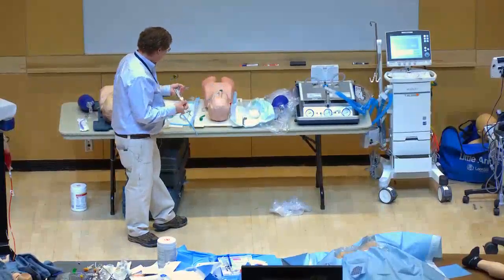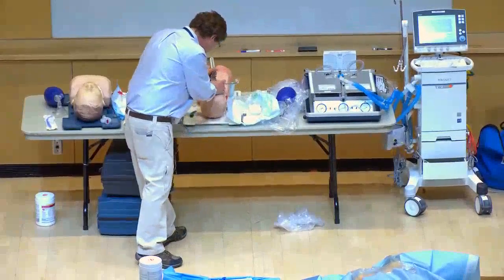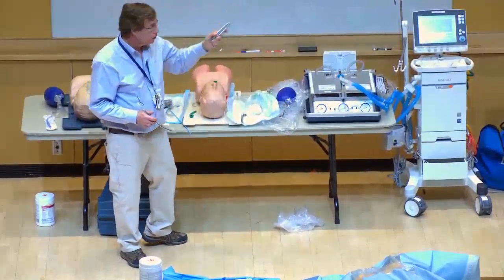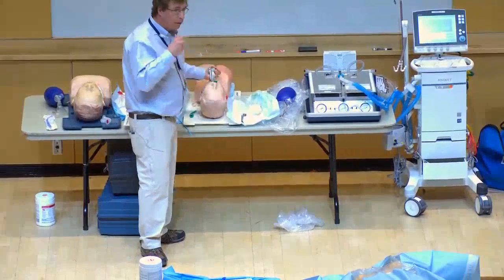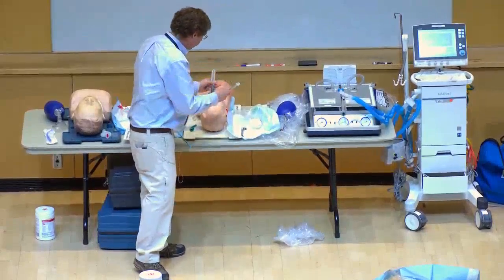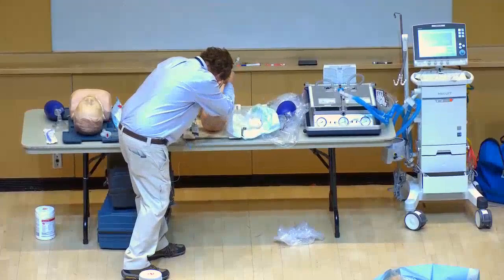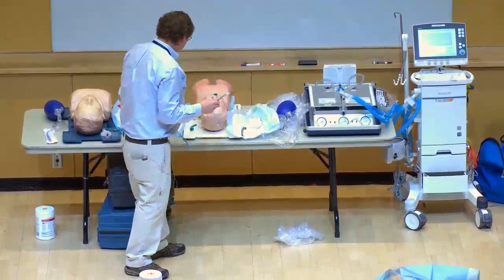For video laryngoscopy with the GlideScope, you insert it similarly to a regular laryngoscope and view on the monitor. The reason we use a GlideScope for COVID is you don't have to get as close to the patient — you can stand further away and pass the tube from a greater distance, providing extra protection. In COVID, ensure the patient is completely paralyzed and anesthetized before starting so they don't cough in your face.